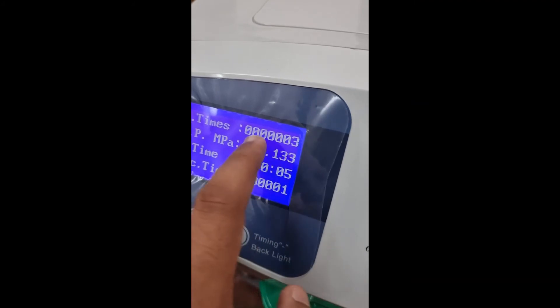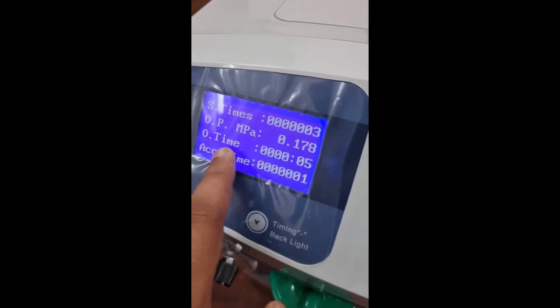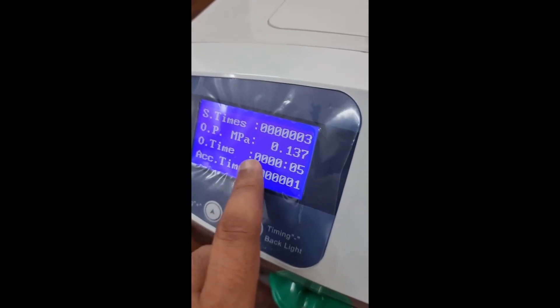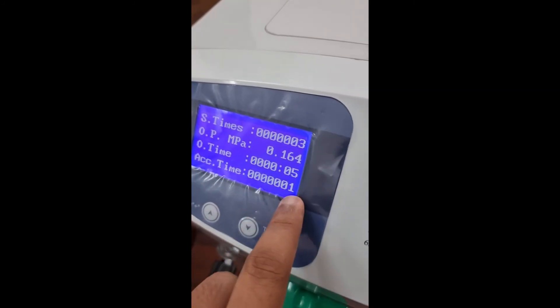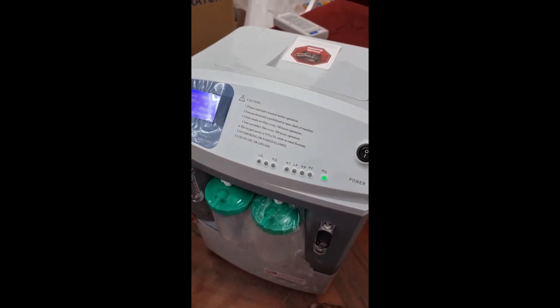The display shows: how many times you have switched on and off (switch time), the pressure it is running at, the operate time for the current cycle, and the total accumulation time — how many hours the machine has run in total.